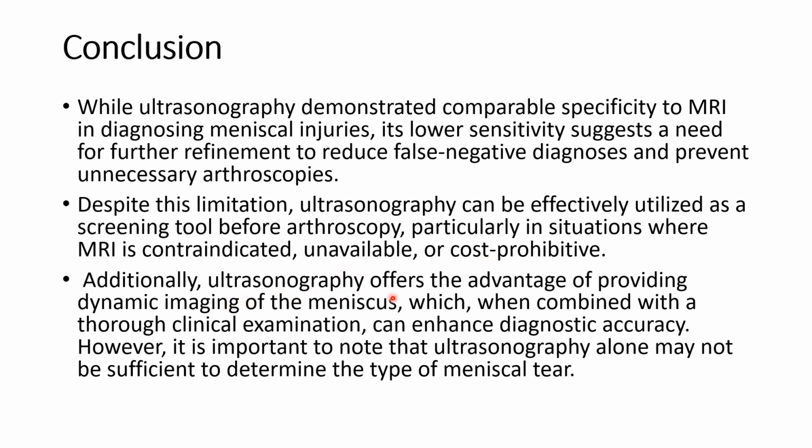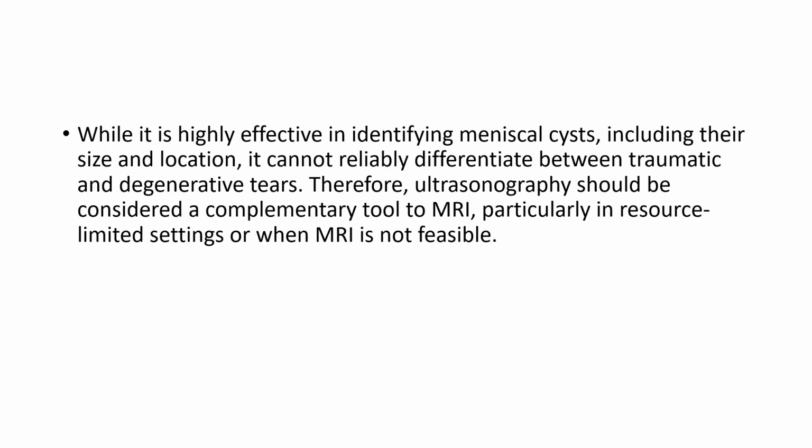Additionally, ultrasonography offers the advantage of providing dynamic imaging of the meniscus, which when combined with clinical examination can enhance the diagnostic accuracy. However, it is important to note that USG alone may not be sufficient to determine tear. While it is highly effective in identifying meniscal cyst, it cannot reliably differentiate between traumatic and degenerative tears, and therefore it should be considered as a complementary tool to MRI, particularly in resource limited settings.